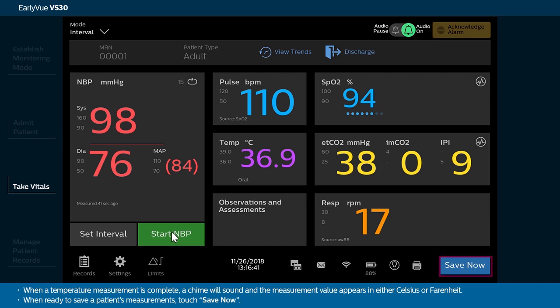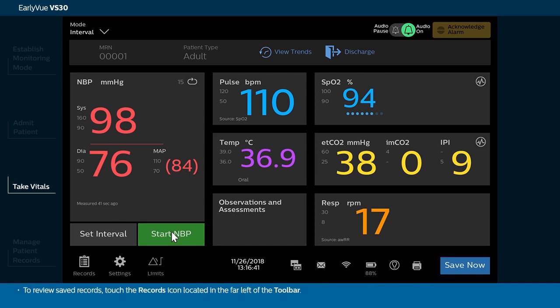When ready to save a patient's measurements, touch Save Now. To review saved records, touch the Records icon located in the far left of the toolbar.